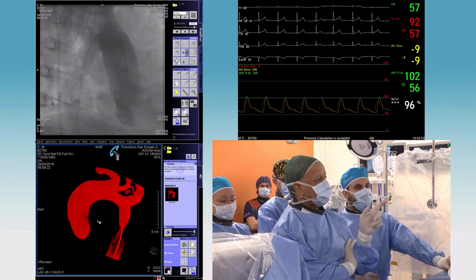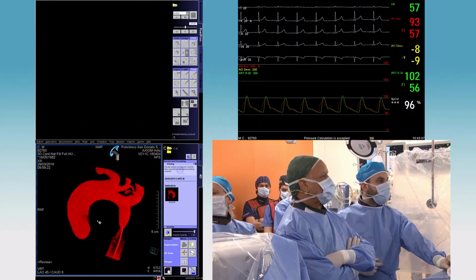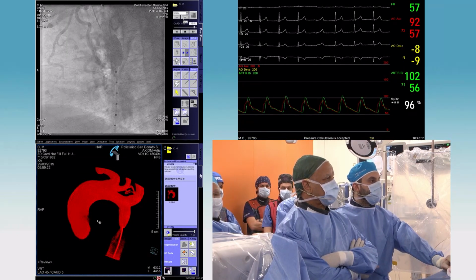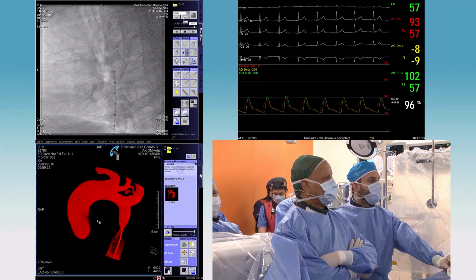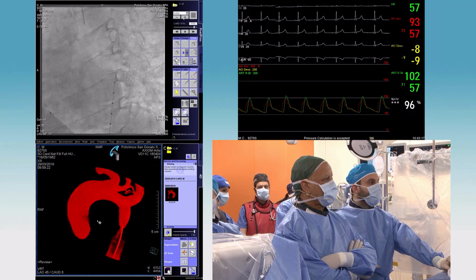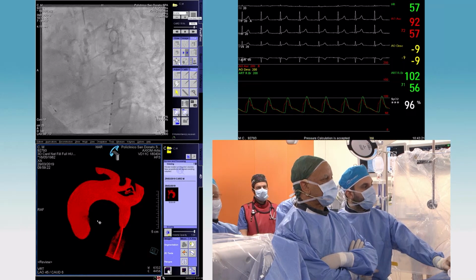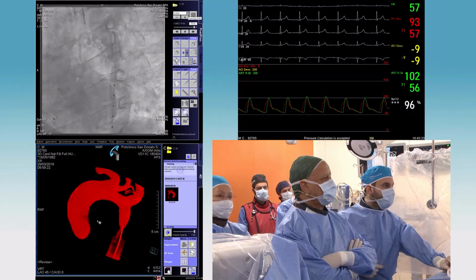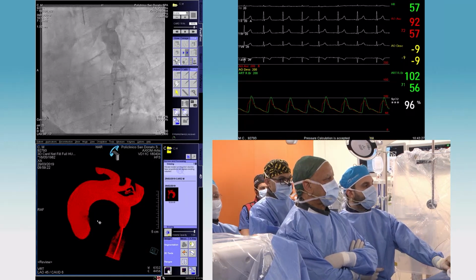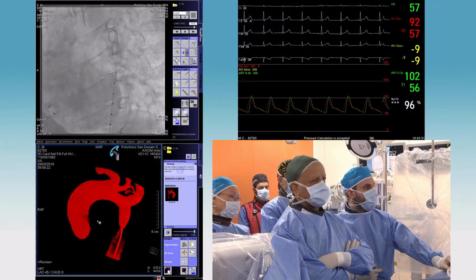So the next thing we did was regular angiograms. If you could show the next picture. There we are with the pigtail just flicked into the left subclavian artery, but that's highlighting the coarctation again. Next one. That's really just a pigtail pulled back with the holes across the coarctation. And you can see, certainly on that projection, a very tight aortic coarctation, and it really shows the anatomy quite well.